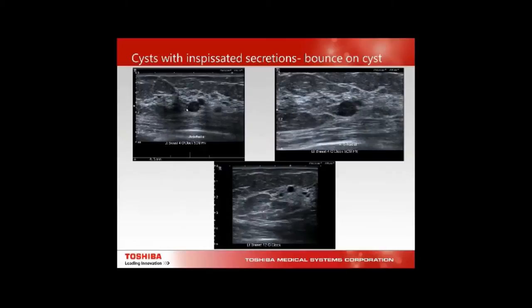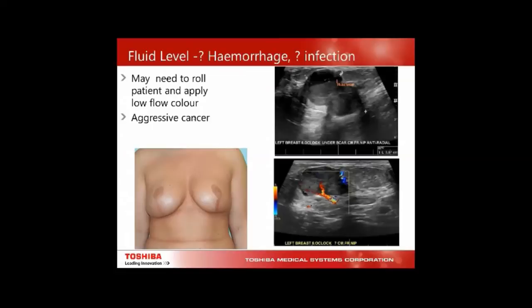Here we have inspissated secretions; we bounce on these cysts and rotate to see if there's mobile product or speculations. This lady had a breast reduction six months before and presented with redness under the scar — it looked like an abscess. But we rolled the patient, applied low flow settings, and found a strong vascular stalk — this was a very invasive inflammatory breast cancer.